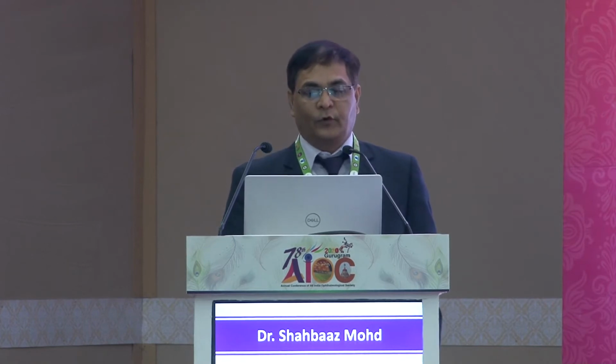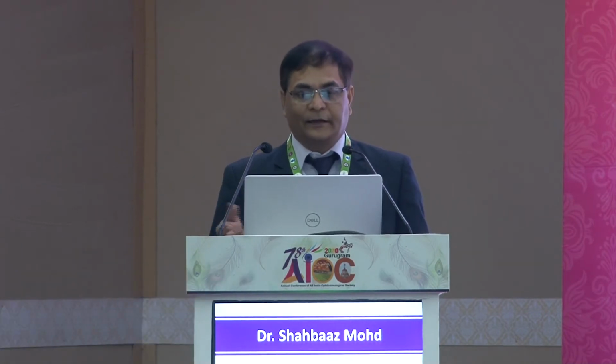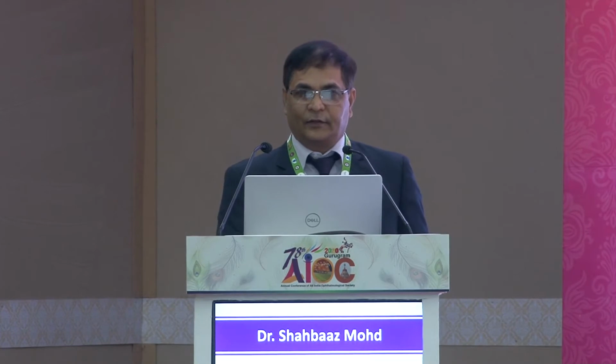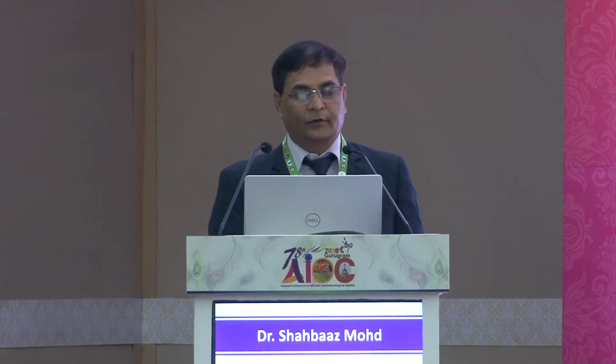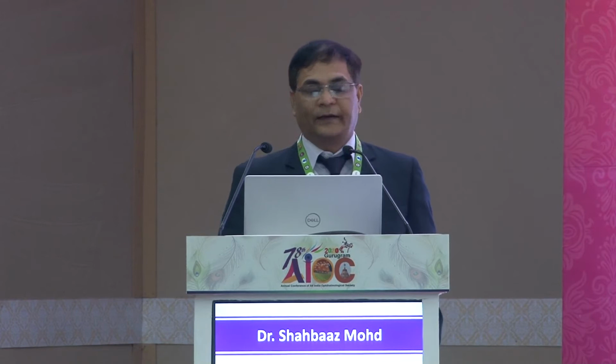In applanation, it is a contact method. The probe comes in contact with the cornea, and if you are not careful and press slightly, the reading will be lesser than the required reading. So this is what you can see. The probe is just touching the cornea, and the beam goes from the corneal vertex to the macula. It should not align to the disc or to any other place. So you will get a reading like this.